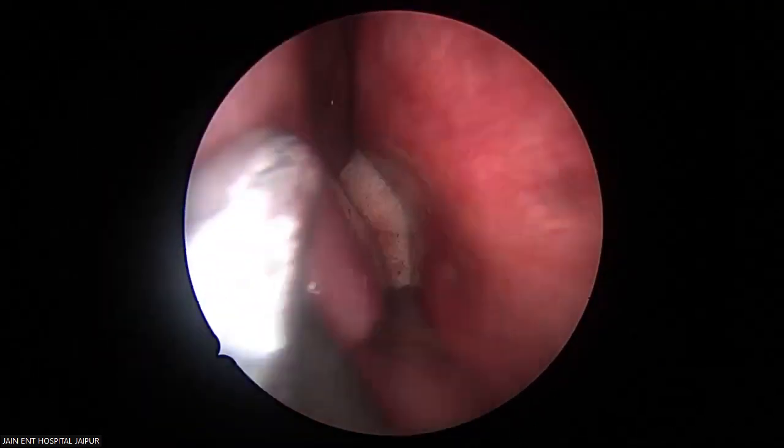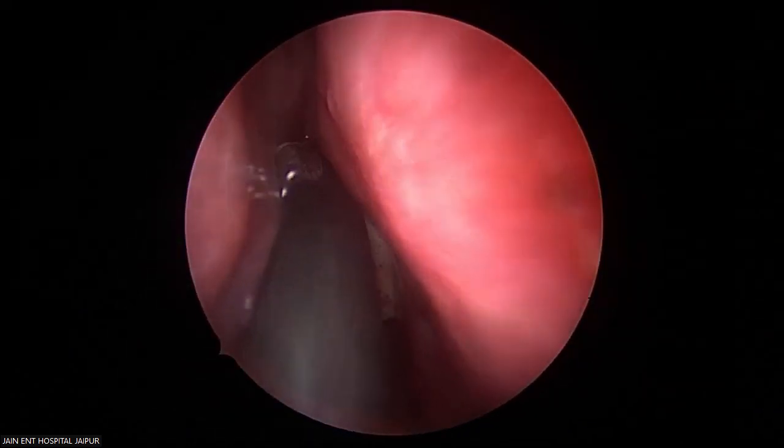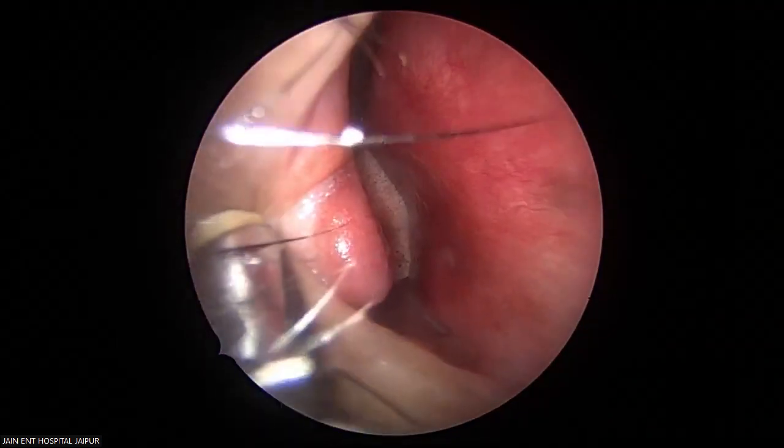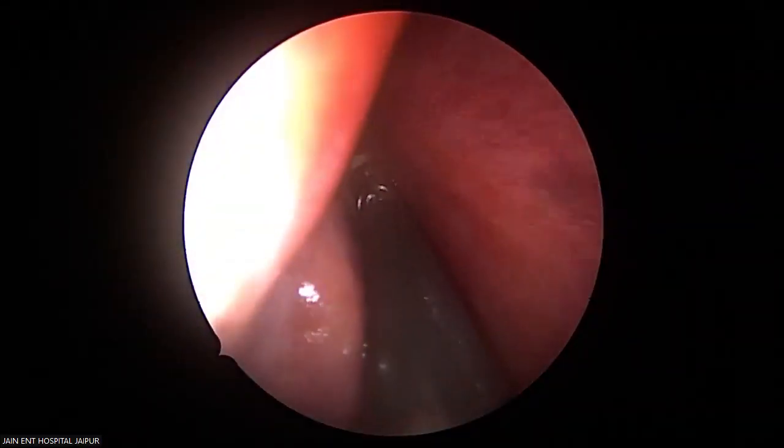We need to remove this entire medial wall. That includes the medial wall of the maxilla and the inferior turbinate as a separate bone. This is the pyriform aperture. Our upper limit is going to be the roof of the maxilla, that is the floor of the orbit.